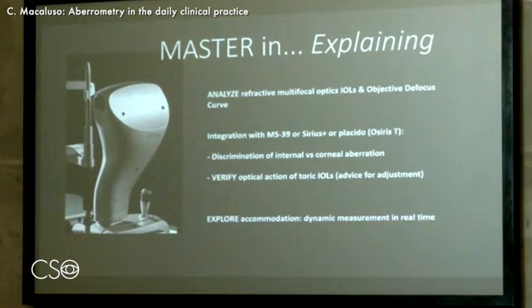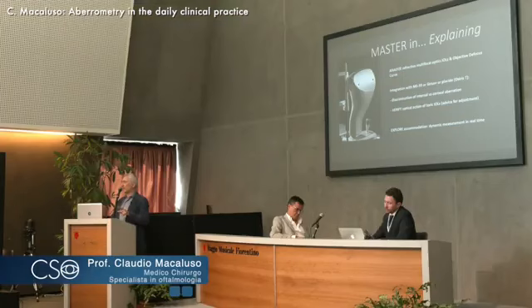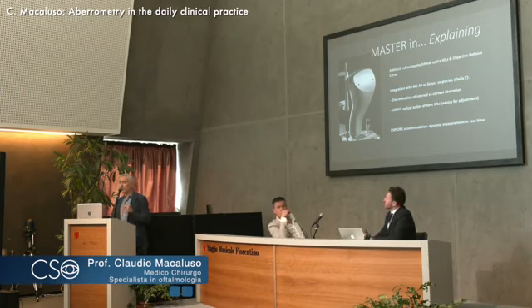also, this is something new and very useful, and I think Francesco is going to talk about this later in the IOL session, but I will anticipate it a little. We can study refractive IOLs very well, and it's very important because nowadays we are using more and more of these refractive multifocal, EDOF, extended depth of field IOLs. So for the distributors, this is a huge potential market, but for us clinicians it is great being able to see objectively these optical effects.